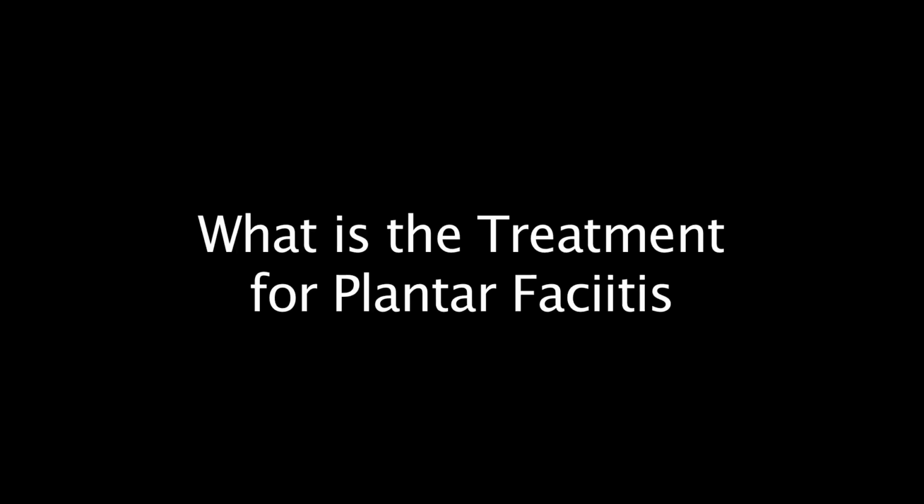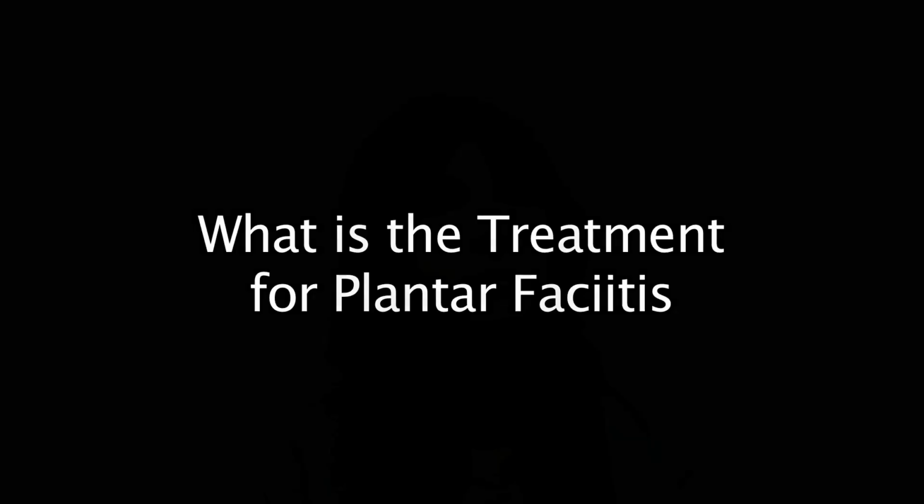So how does one treat plantar fasciitis? The typical treatments for plantar fasciitis are cortisone injections, arch support, physical therapy, icing, stretching. However, if you've tried all those and they have not worked, and this has continued on for months, the ideal treatment and a great alternative to surgery, which I don't recommend, is ESWT, or extracorporeal shockwave therapy.